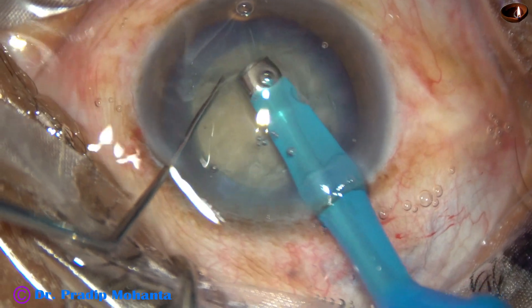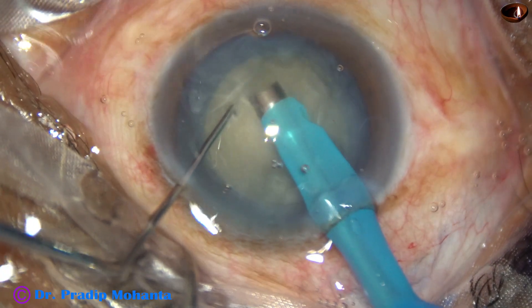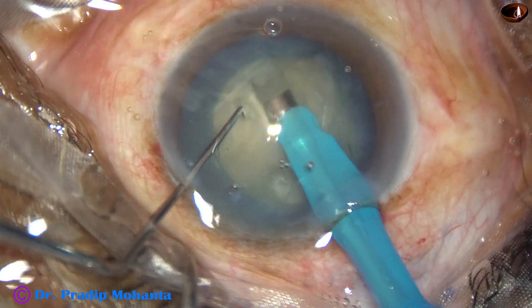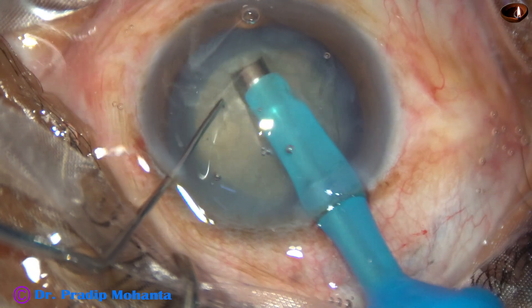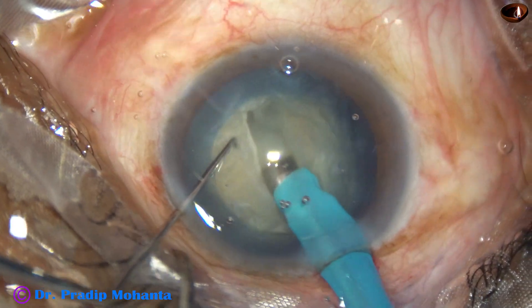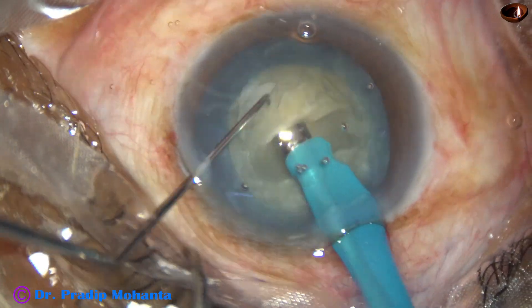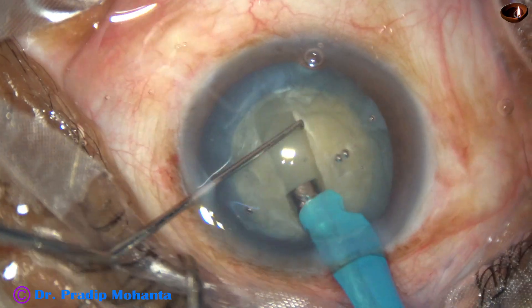This is the first sculpt. Then the second, going to the anterior end — the lower end of the trench. The ultrasonic energy and vacuum is turned off, only irrigation remains on, and we come back. Again, start with aspiration and ultrasonic energy. The trench is made, and now at 90 degrees, this is another trench.